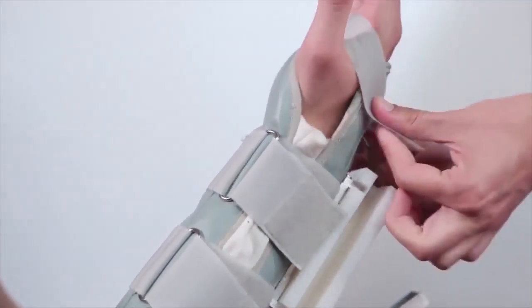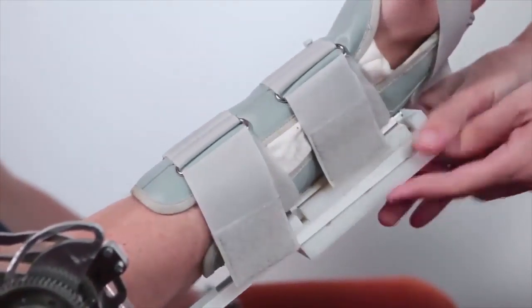The wrist orthosis provides secure and comfortable stabilization of the forearm in various angles.